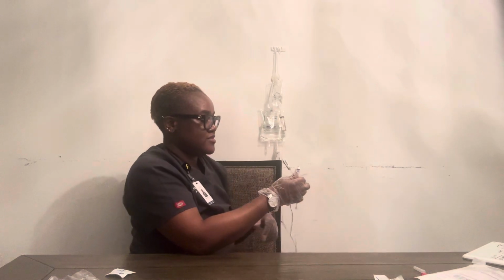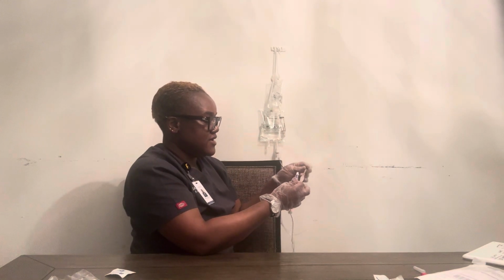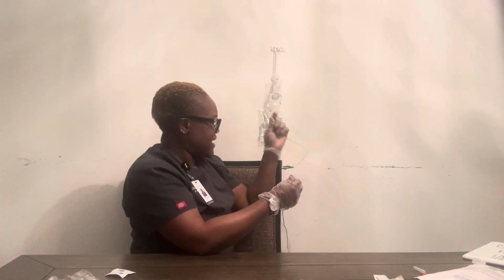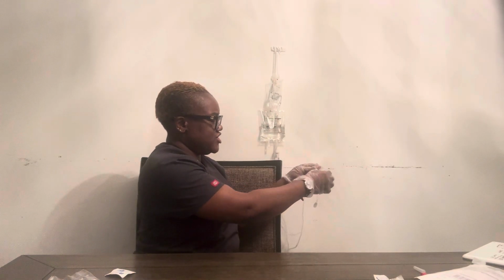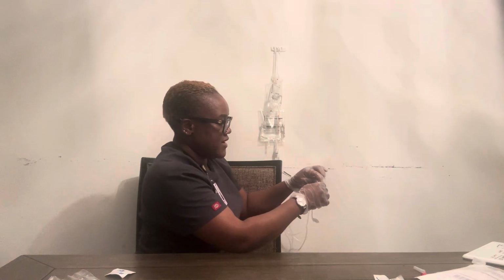I'm gonna allow it to dry. And once it's dry, I'm gonna attach my amoxicillin medication to my primary line.